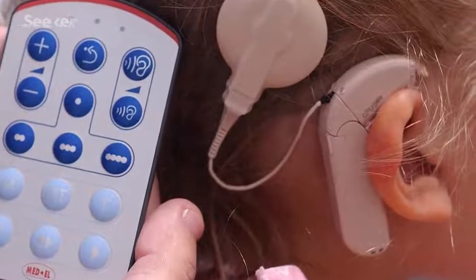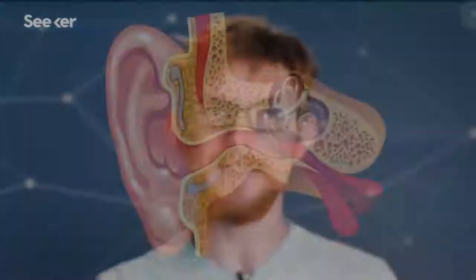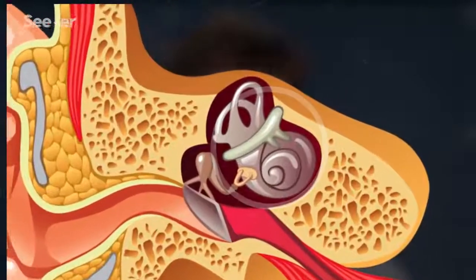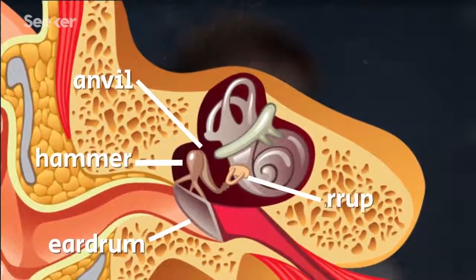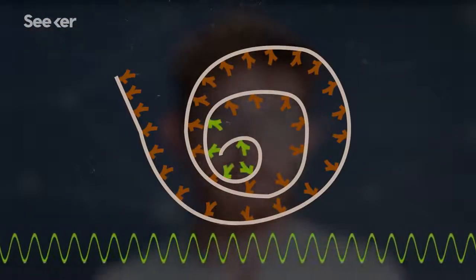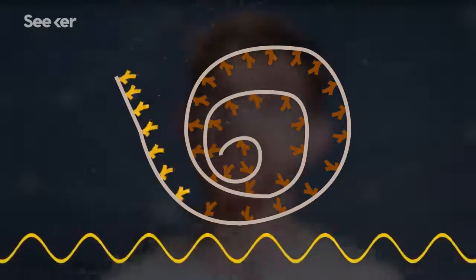A cochlear implant is a medical device that goes, as the name suggests, inside your cochlea. Quick refresher, that's the spiral structure of 3 fluid-filled canals coiled up like a snail shell in your inner ear, past the eardrum, hammer, anvil, and stirrup. In one canal, there are hair cells along the length of the spiral. At the base of the spiral, the hair cells respond to higher frequency sounds, and at the apex, they move at low frequencies. These movements trigger nerve cells, converting the sound waves to electrical impulses and passing the signal onto the brain for processing. That's just a basic overview of how it all works, assuming it does work.